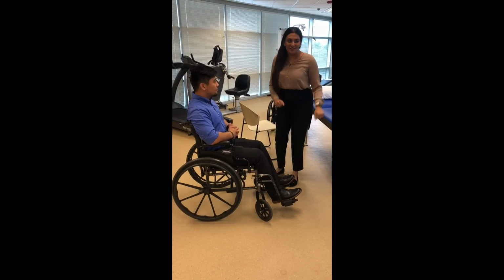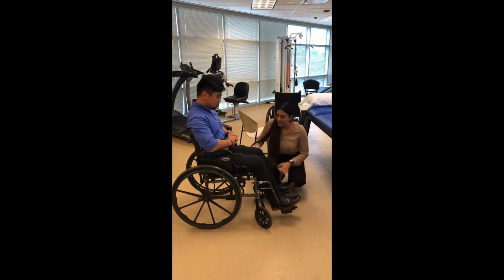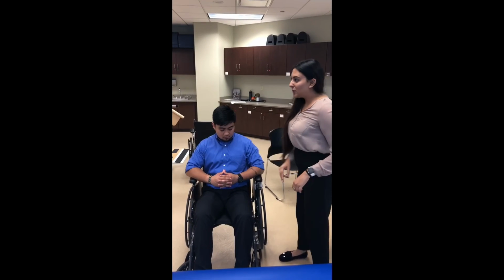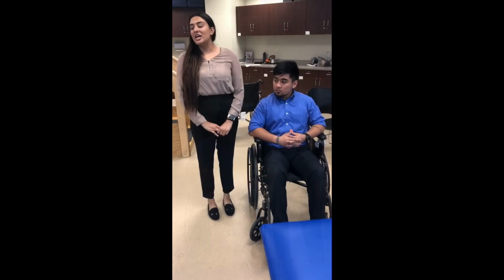Okay, so now on to confirming. First, we're going to confirm seat depth. So we're going to put 2 fingers horizontally between the popliteal fold and the edge of the seat. Okay, so next we're going to confirm seat width. So in order to do that, we're going to put 2 fingers horizontally or vertically in between the hips and the wheelchair. Next, we're going to check seat height.